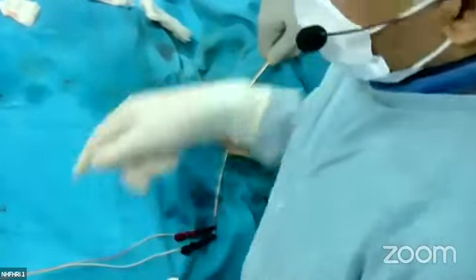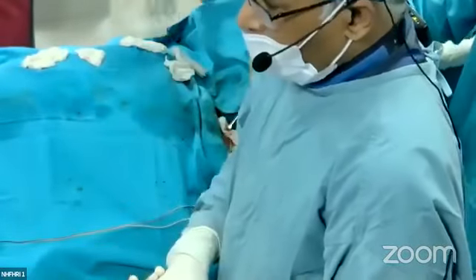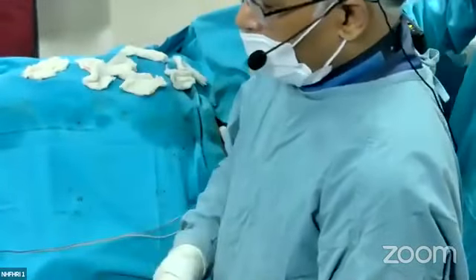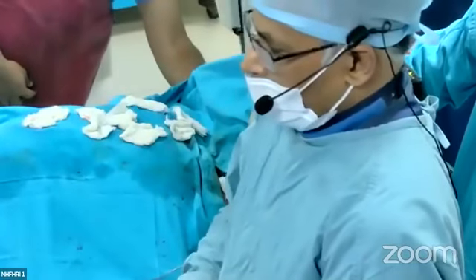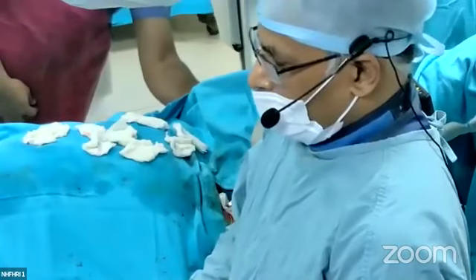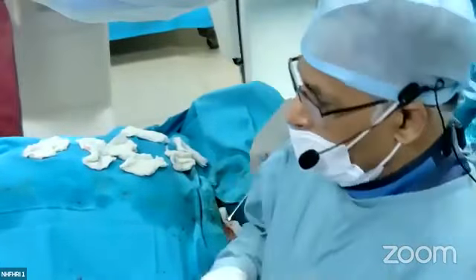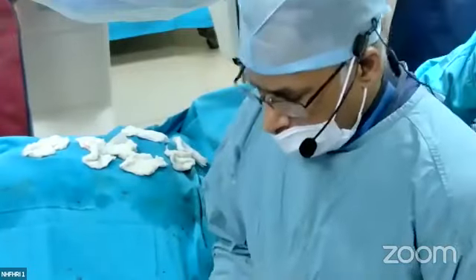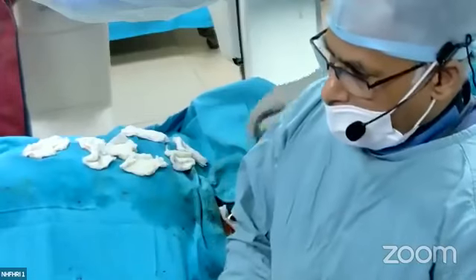This patient had atrial fibrillation, paroxysmal atrial fibrillation. The patient was on warfarin. We have stopped warfarin for 4 days. If the patient is on warfarin, it should be stopped. Even rivaroxaban should be stopped 3 to 5 days. Warfarin should be stopped 5 to 7 days. And when the INR comes down below 1.5, we can do the procedure.